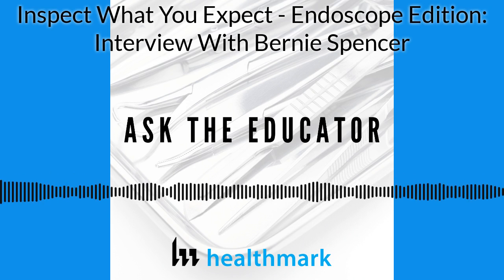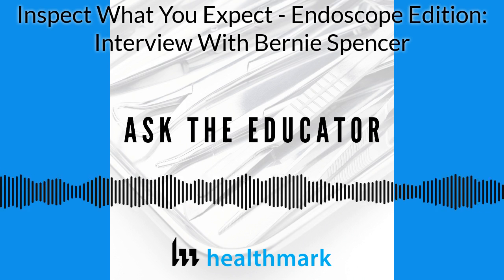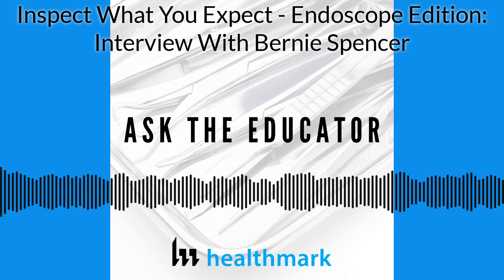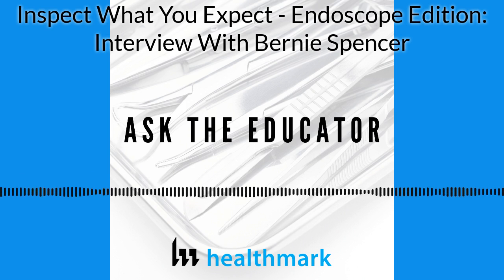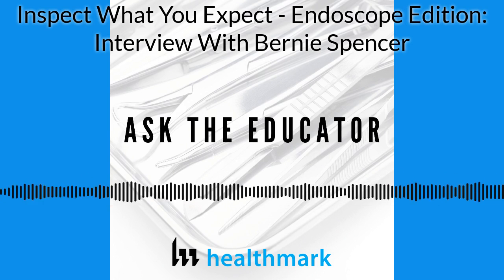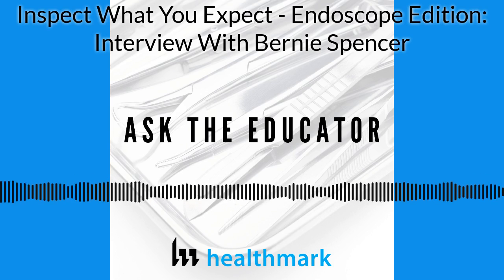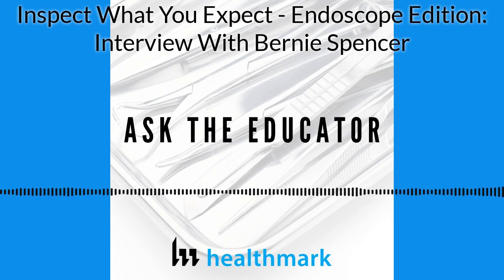As a result of doing this testing, we had some failures. In a few instances, we had to reprocess the scope 3 additional times to get a passing result. Now, mind you, there was no visible debris on the brush after each of those cleanings. So I could have assumed that channel was adequately cleaned and moved on, but these tests proved otherwise.